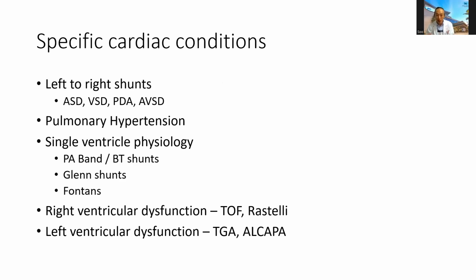Let's say you want 8 mils, but you put an I time of 0.3 seconds. With that 0.3 seconds, you need a pressure of 25 in order to deliver the same tidal volume. So that is not very practical. You have a very high pressure, but the I time is very short. So we balance it by increasing the I time, and you can reduce the peak pressure. Does that answer your question?